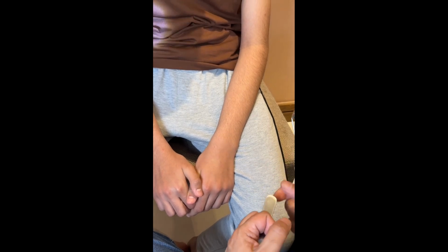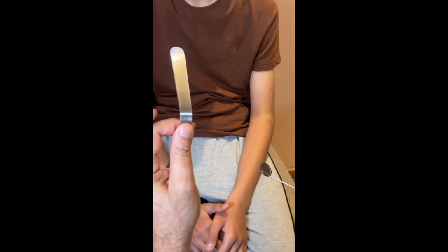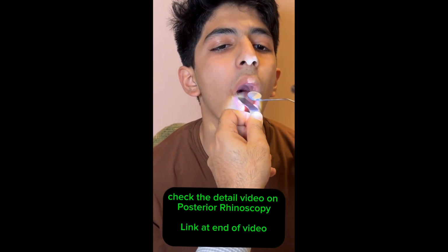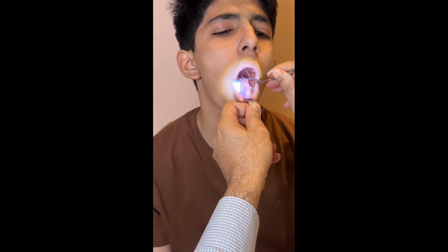ठीक है. The mirror should be held in our right hand while the tongue depressor should be in our left hand. मुंह खोलें. शाबाश. जुबान अंदर रखनी है. आराम से. शाबाश. आ बोलें. आ आ. Okay, good. So this way we have examined the nasopharynx. The other methods to examine the nasopharynx are via the rigid nasoendoscope or the flexible nasopharyngoscope.